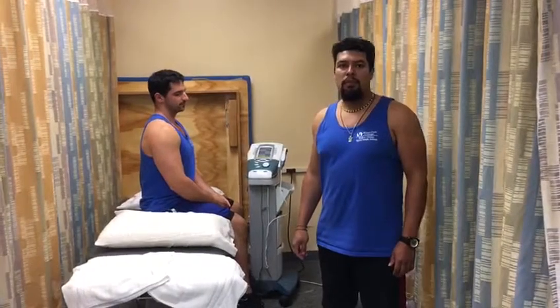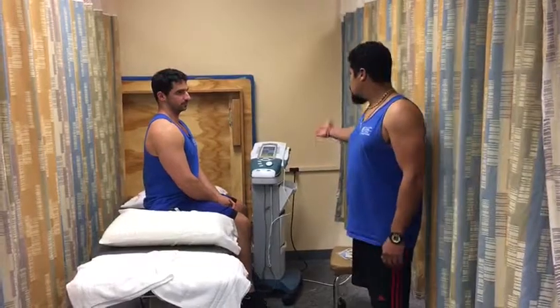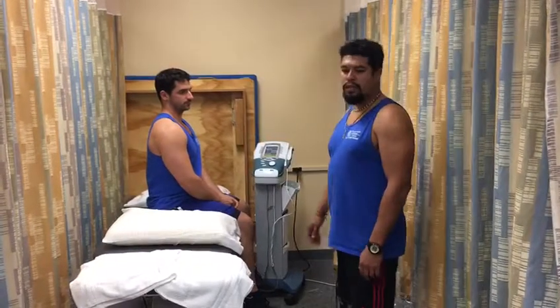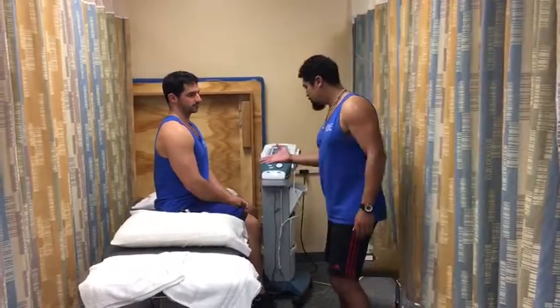Hi, my name is Rafael, and I'm a physical therapist assistant student here at Miami-Dade College. I'm going to be using electrotherapy today on Daniel, who has an acute sprain/strain to the lumbar spine.